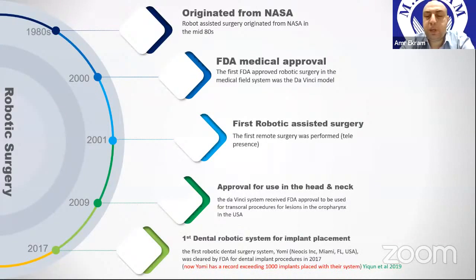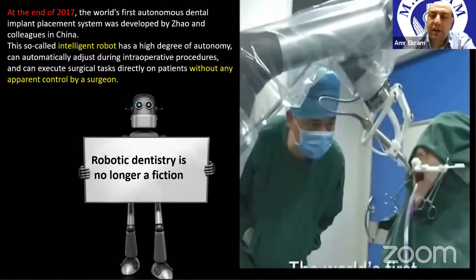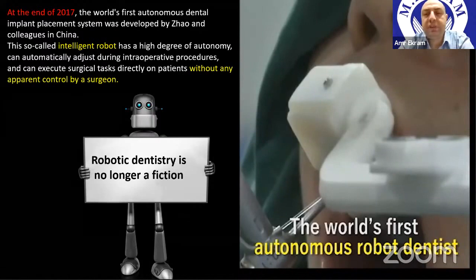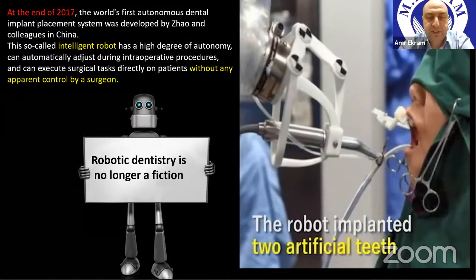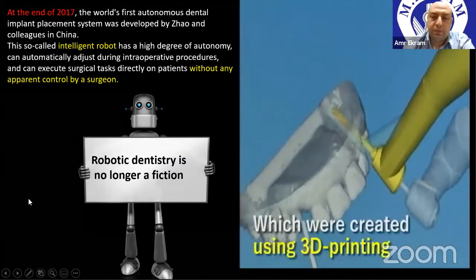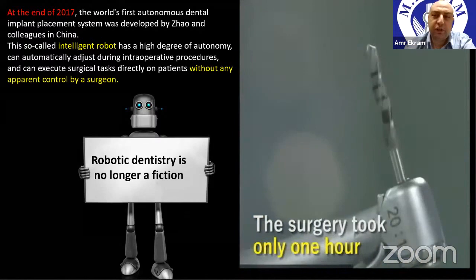The first robotic system for implant placement was introduced to the market just 4 years ago, in 2017. So it's available already in the market. And also in 2017, we had the first intelligent robot in China that could place implants on its own without any assistance from the dentist. The robot can detect the patient position and place the implant on its own. So hopefully our jobs will be easier in the future, but unfortunately, of course, it will be more expensive.